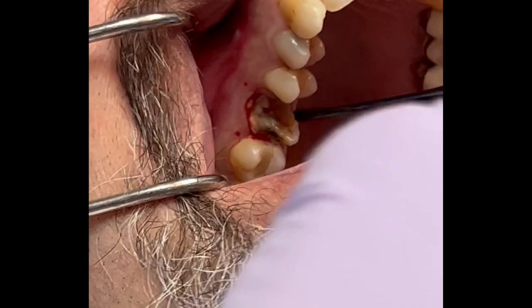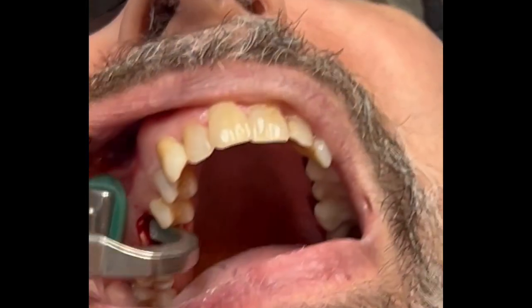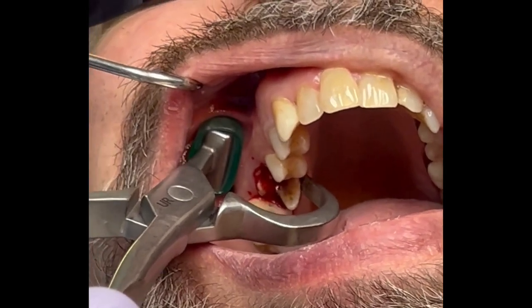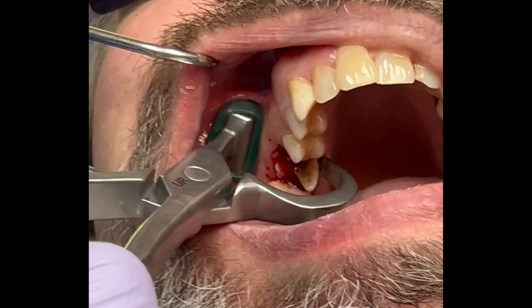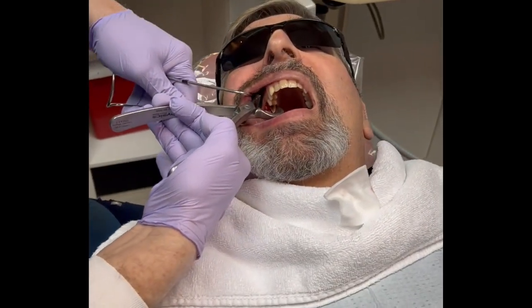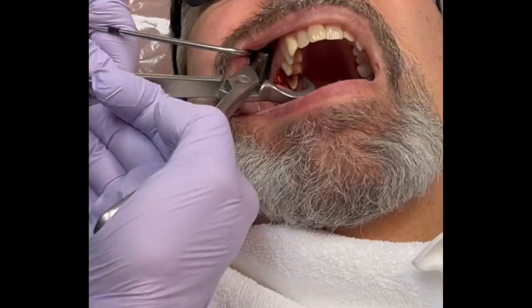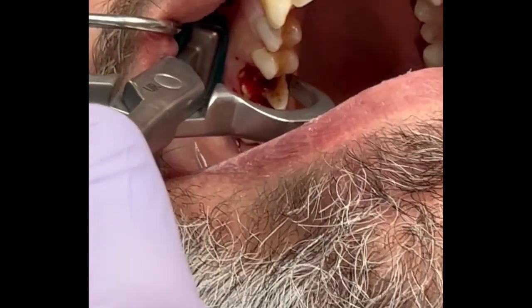It's imperative that we instruct or communicate with our patients the importance of grafting the site. Now, grafting can become complicated and can be relatively expensive in material costs. What I like to use is the osteogen plug material, which is a calcium apatite in a bovine Achilles tendon matrix.